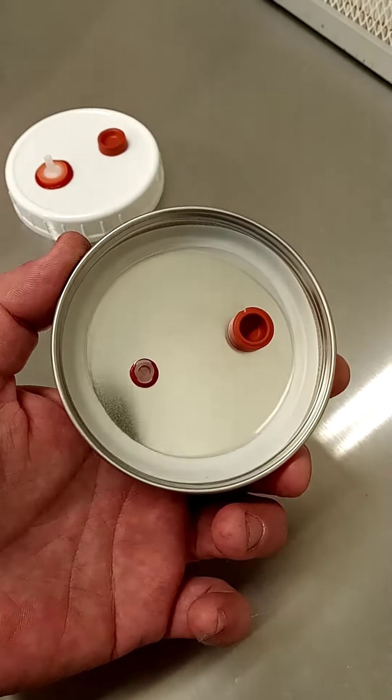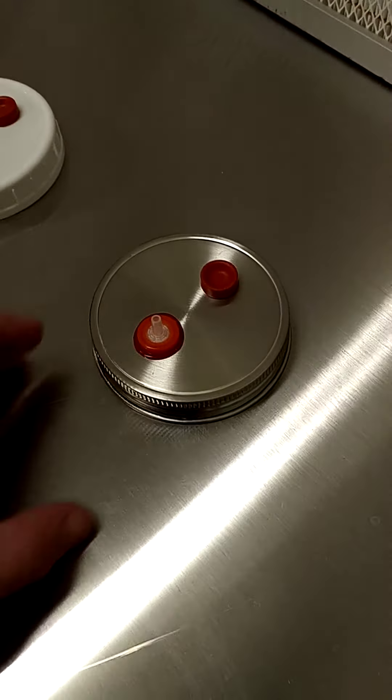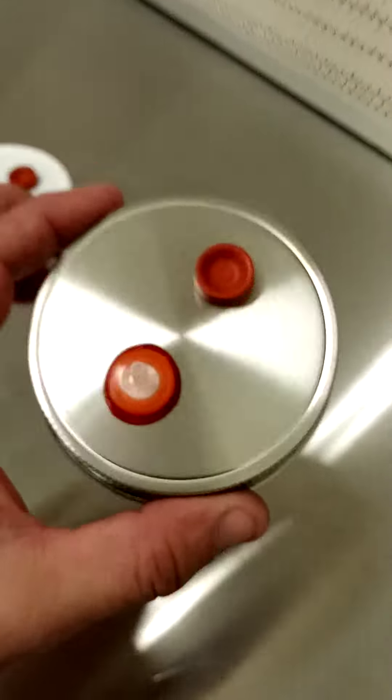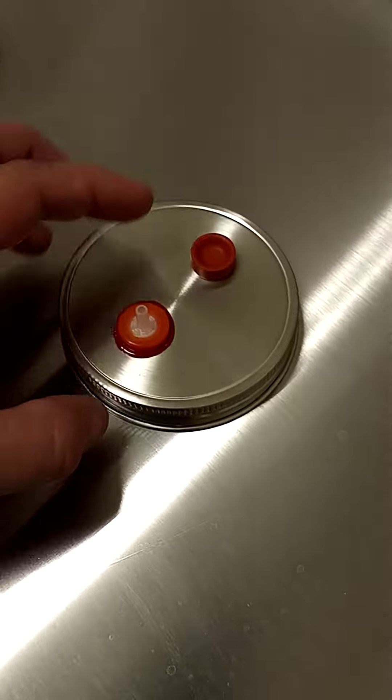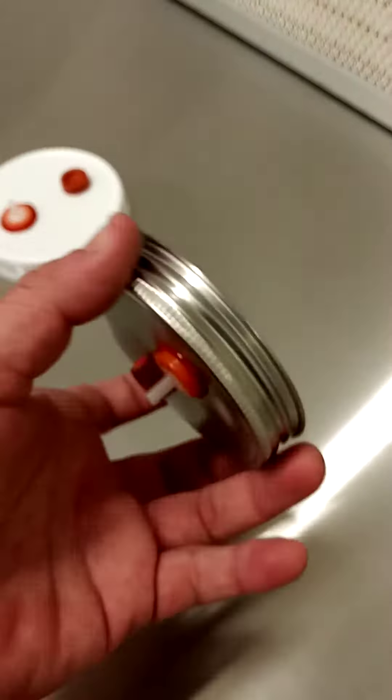We've switched our whole operation to these and they're so much better. They do not expand over time, they last forever. Anytime we need to renew or rejuvenate them, we simply pop off these ports and replace them with new ones. These lids are absolutely wonderful.